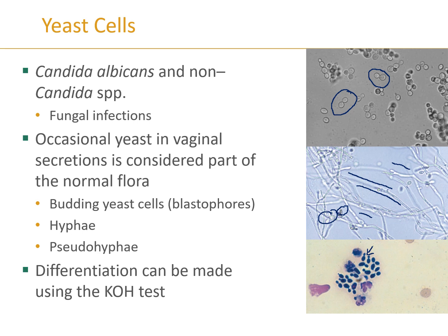And of course, as previously mentioned, if you're confused whether it's a red blood cell or a yeast, we're looking for the budding, because red cells do not bud. And you could potentially do a KOH wet prep, where you add the KOH, the potassium hydroxide solution, into an aliquot of the sample. What that will do is dissolve those red cells and leave those yeast so that you can visualize them a little better.